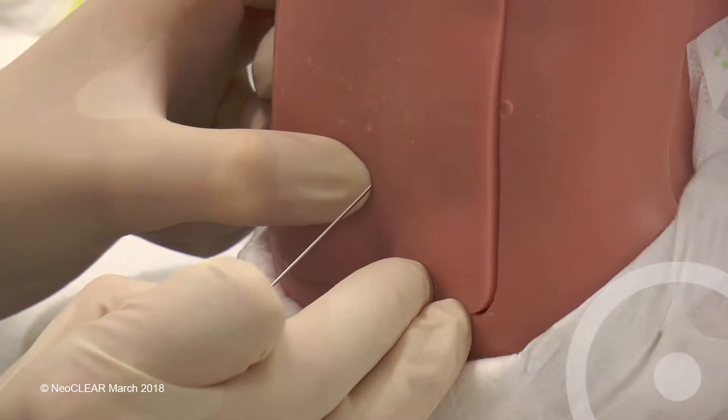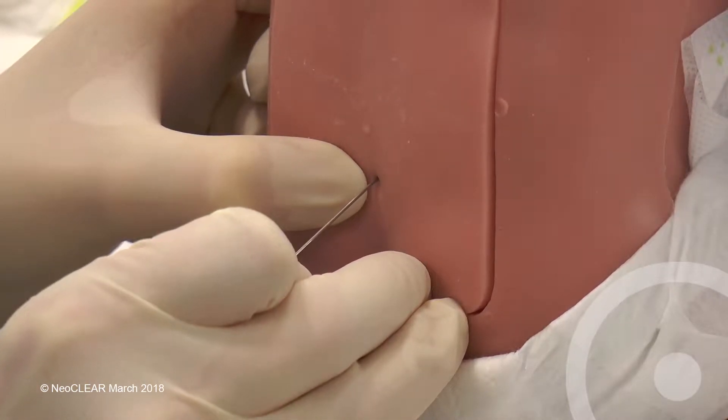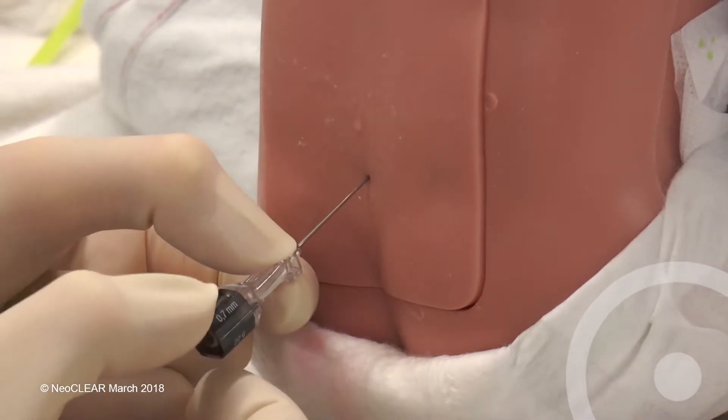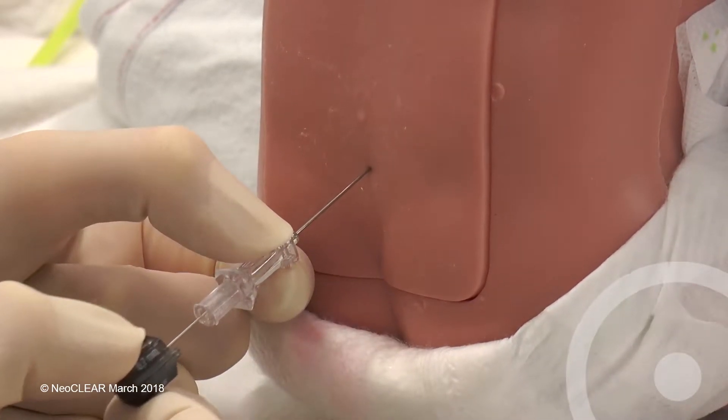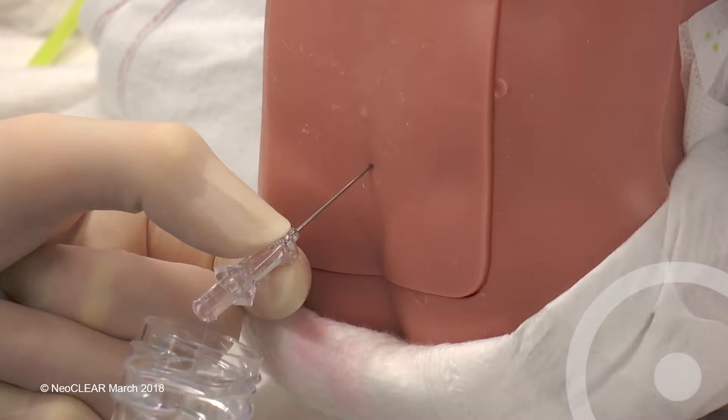With the baby in the sitting position, insert the needle angled towards the umbilicus with the bevel facing to the infant's side. For late stylet removal, slowly advance the needle with the stylet in place until it is felt to be in the CSF space. You may not feel a clear change in resistance. Remove the stylet and collect CSF. If CSF is not flowing, consider rotating the needle to face the bevel towards the head, massaging the fontanelle, or slowly advancing or withdrawing the needle depending upon the position.